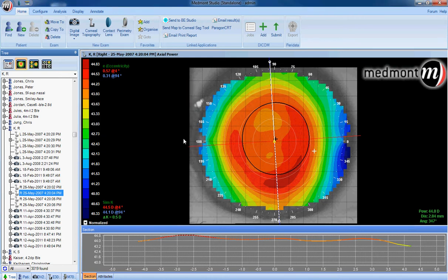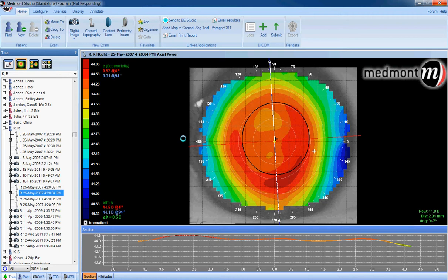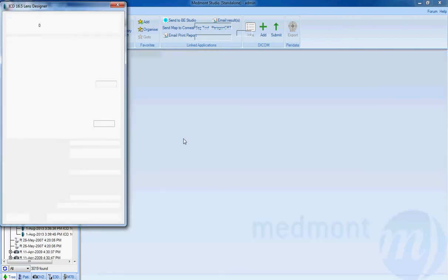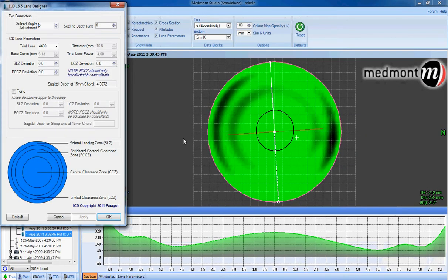The software will then generate a theoretical contact lens and place it on the topographical surface. This shows you where the lens should bear and lift.